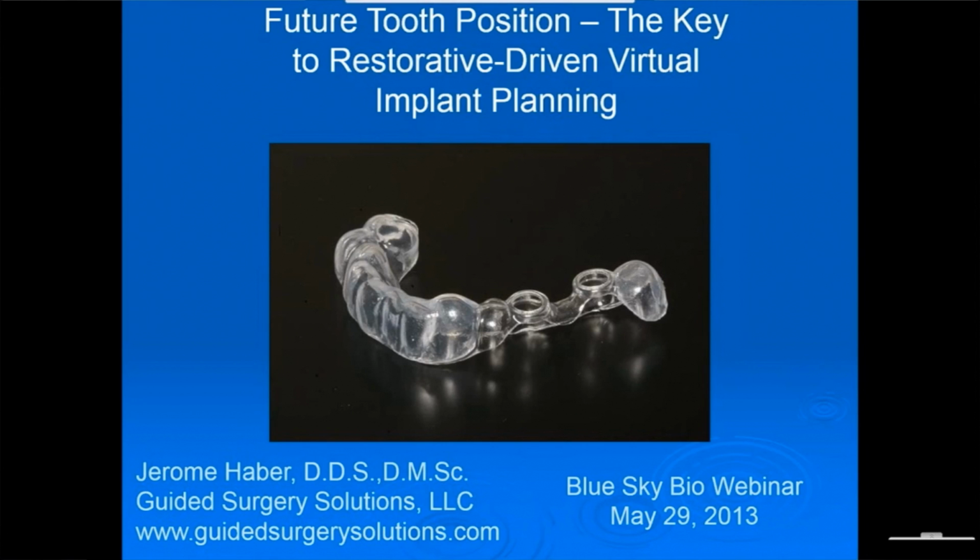We at Guided Surgery Solutions have attempted to streamline the virtual planning process by incorporating scans of readily available models into the Blue Sky Plan planning software. Before we start, I would like to present an overview of our patent-pending guided surgery system.